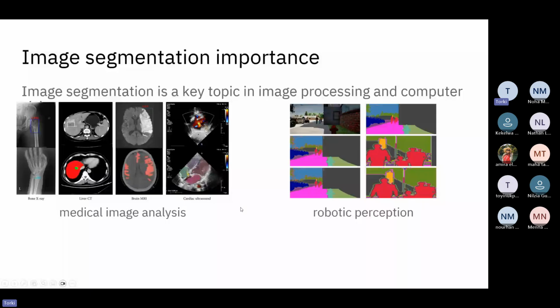So the purpose of the slide on the left part is that the segmentation task is to highlight this part and give it the same color coding, and highlight the other parts and give them the same color coding, and the same here.